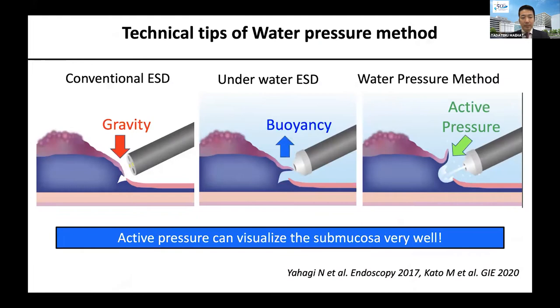This schema shows the concept of the water pressure method. In duodenal ESD, the submucosal layer is difficult to visualize even after making a mucosal incision due to gravity. After filling the inside of the duodenal lumen with saline, the mucosal flap is floated by the buoyancy force. Water pressure using saline solution through the water jet channel further expands the submucosal space and improves visualization of the submucosal layer, making it easier for the endoscope to penetrate the submucosal layer and allowing treatment to be performed under stable conditions.